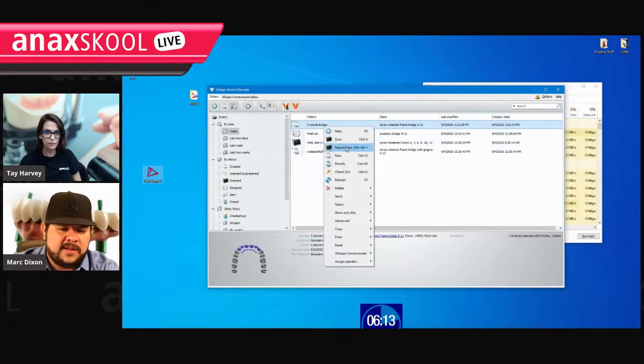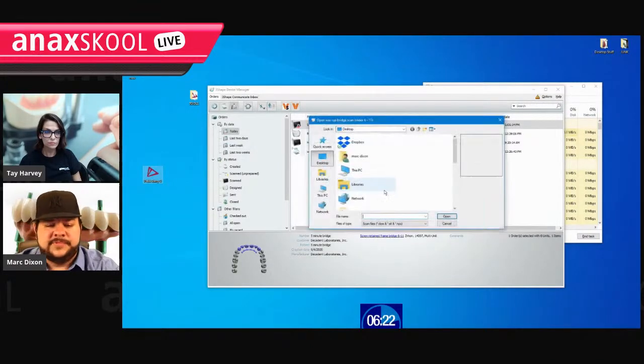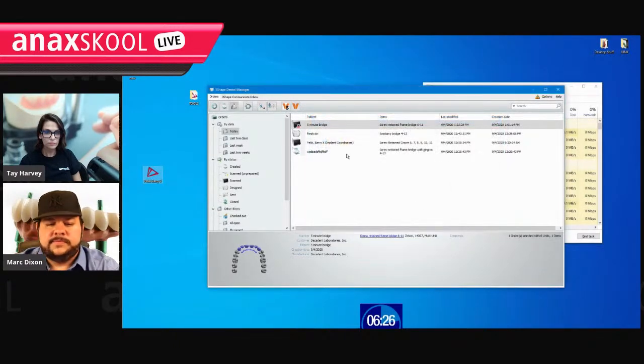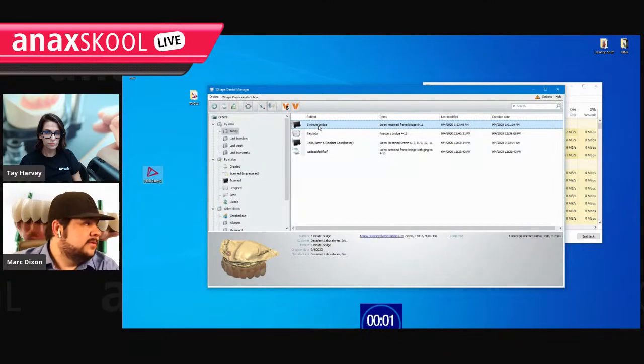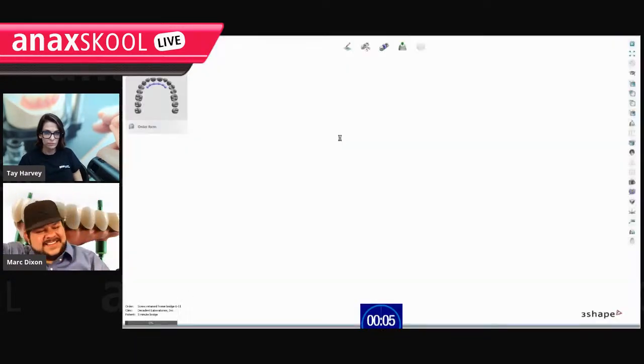Okay. Right click, import. Do I want to use the existing preparation scan? Yes, because there was no problem with it. Do I want to use the existing other thing that had a problem with it? No. So it's going to let me choose another one. And we're going to choose that same one I just overwrote. All right. So six minutes to fix it. Still better than, you know. All right. Reset the timer. Design. All right. I'm going to click next, because you guys already saw.